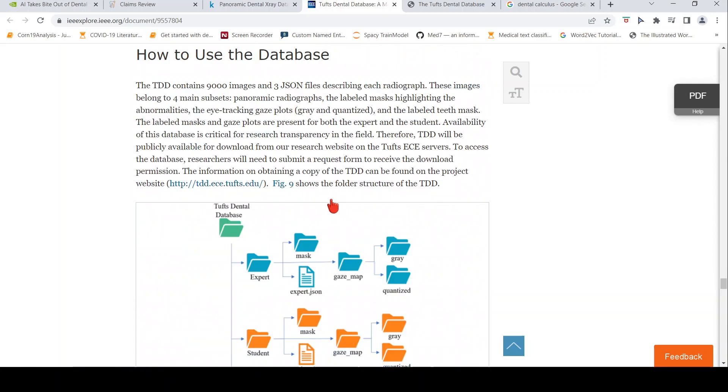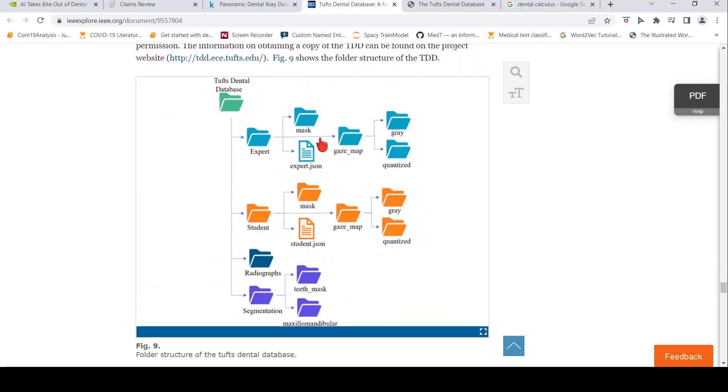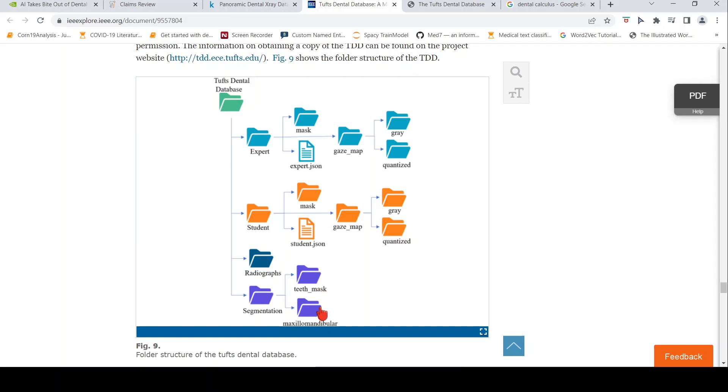Here are further details on that. There is an expert JSON, there is a student JSON of the annotations. And they also have the segmentations of the teeth mask as well as the maxillomandibular region. This is how the database is organized.